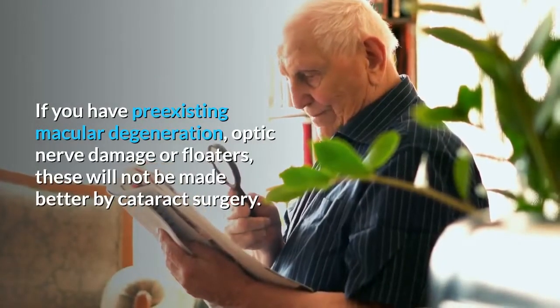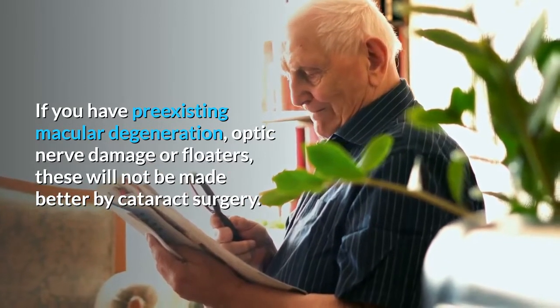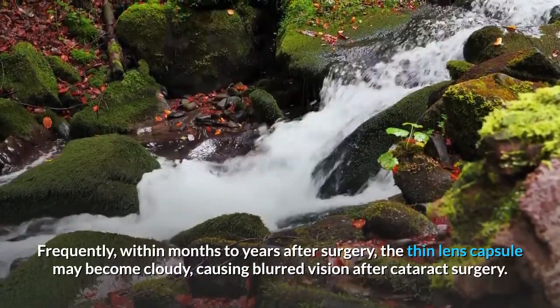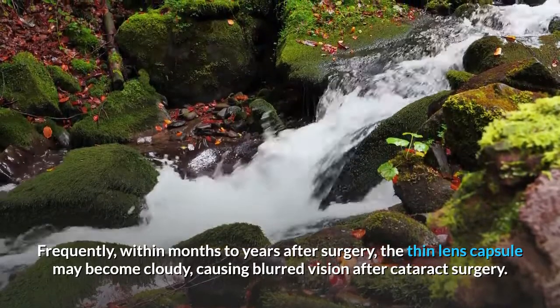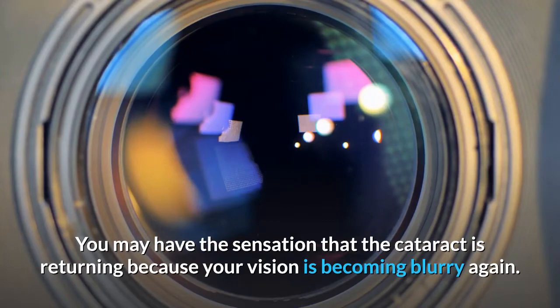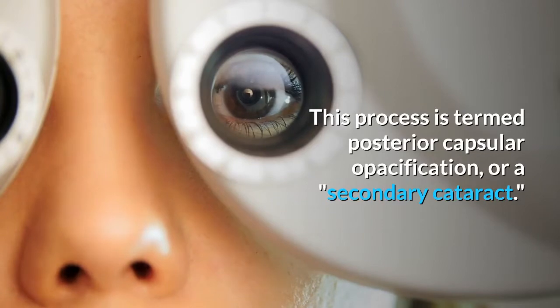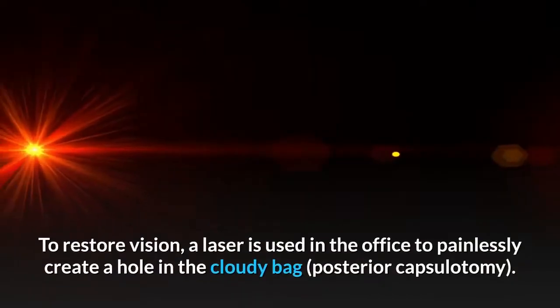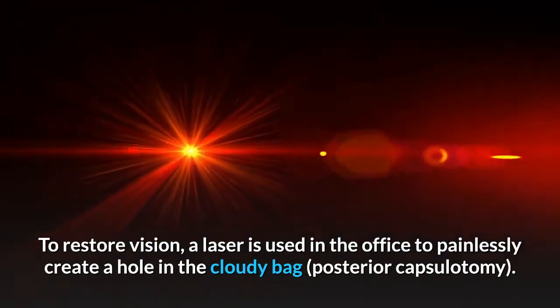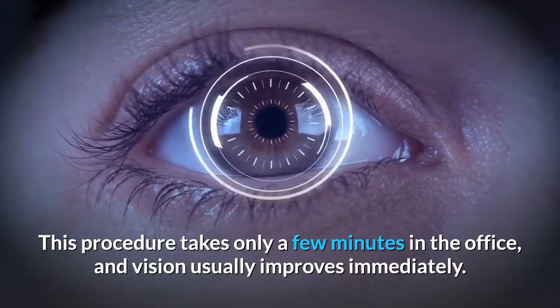If you have pre-existing macular degeneration, optic nerve damage, or floaters, these will not be made better by cataract surgery. Frequently, within months to years after surgery, the thin lens capsule may become cloudy, causing blurred vision after cataract surgery. You may have the sensation that the cataract is returning because your vision is becoming blurry again. This process is termed posterior capsular opacification, or a secondary cataract. To restore vision, a laser is used in the office to painlessly create a hole in the cloudy bag, known as a posterior capsulotomy. This procedure takes only a few minutes in the office, and vision usually improves immediately.